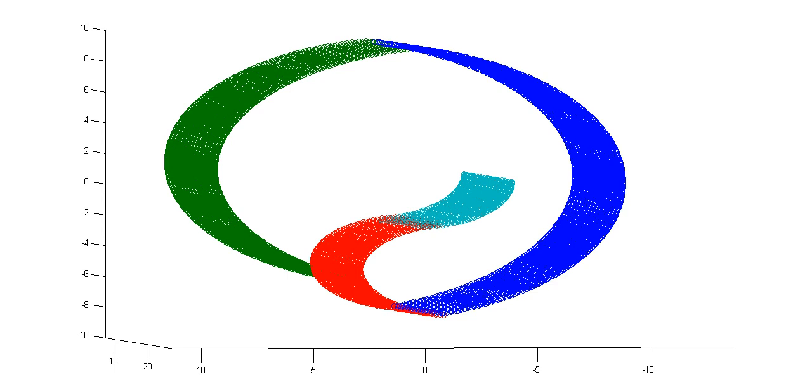And then you could imagine generalizing this kind of logic to many other kinds of things. So instead of the flickering of the screen, you would show different kinds of images, and you would say when a certain kind of image, like a face, is present versus a non-face image, only certain brain regions involved in faces will have activity. So you can correlate the activity: is the face present, and is the brain region active?